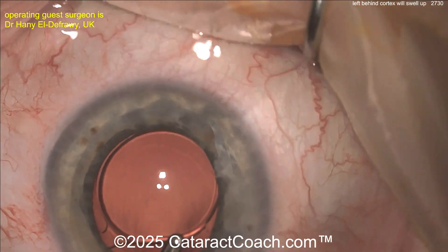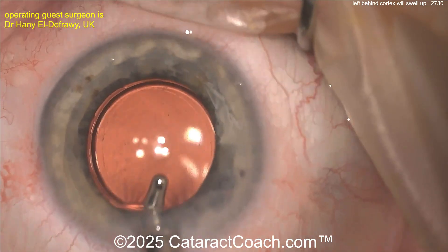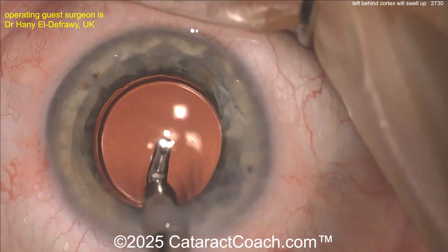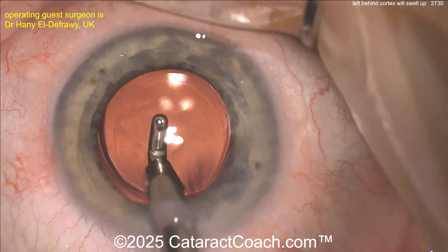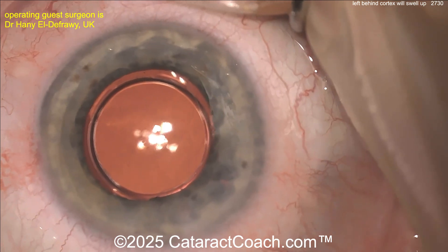Going behind the IOL optic to remove all that material — I think that's enough, you have all the material out. Let's seal up the incisions. Since you're already back in the operating room, you may as well check where the astigmatism is and see if you can do an LRI — a limbal relaxing incision — to help neutralize the astigmatism. Now the patient is going to be much happier.